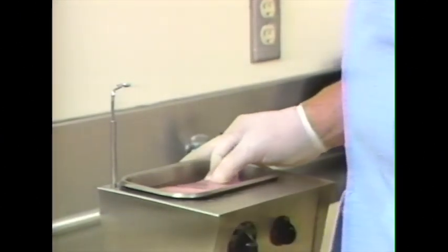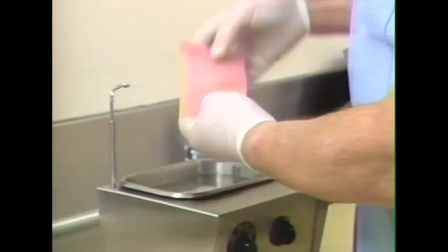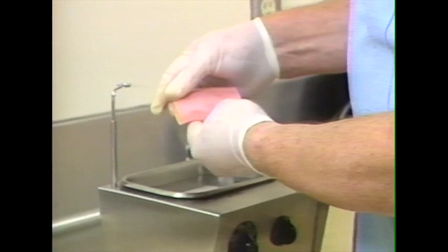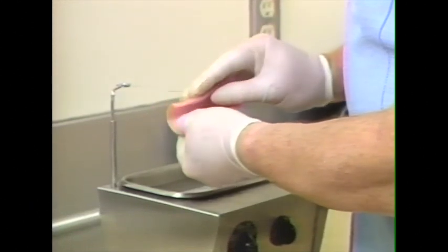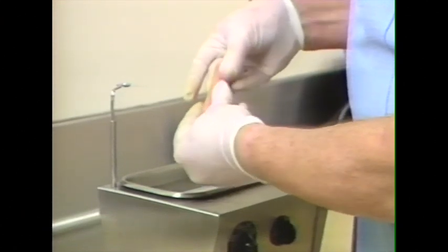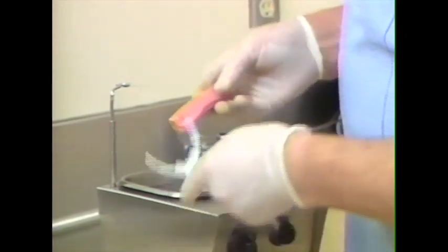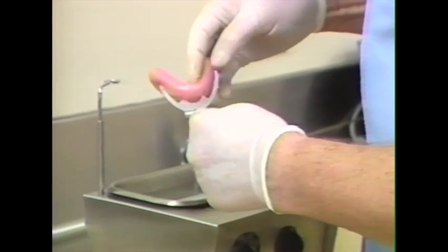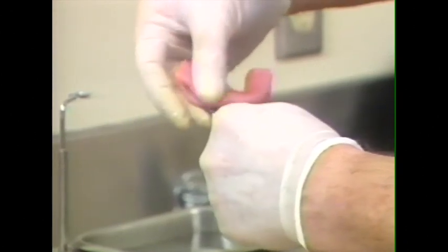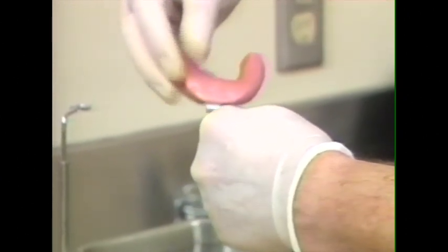So we have one piece of baseplate wax that we're heating in the compound heater here at 140 degrees, and we're going to fold this wax once, twice, and 3 times, and form a roll, then stretch it out slightly and attach it to the Facebow fork, folding it over both sides of the fork so that there's an even layer of wax on each side of the fork.